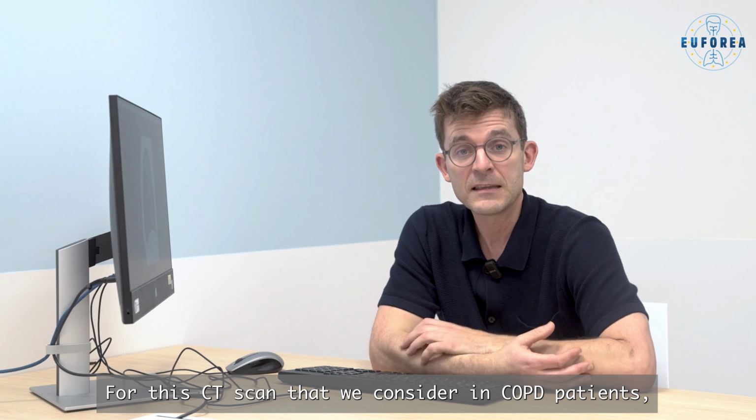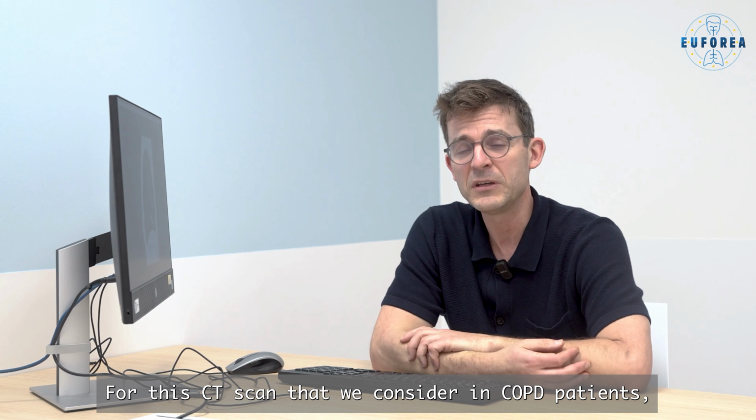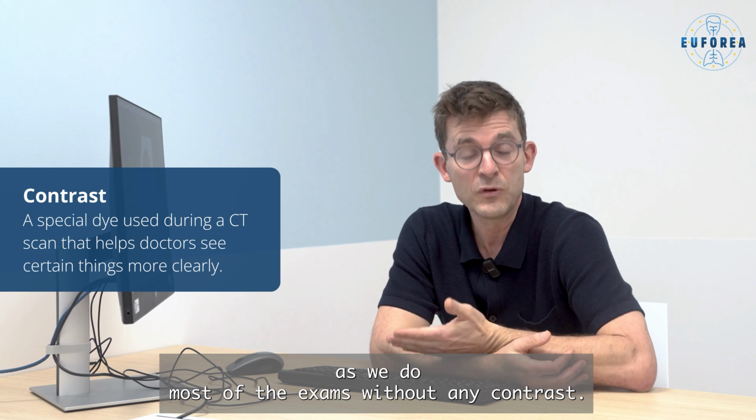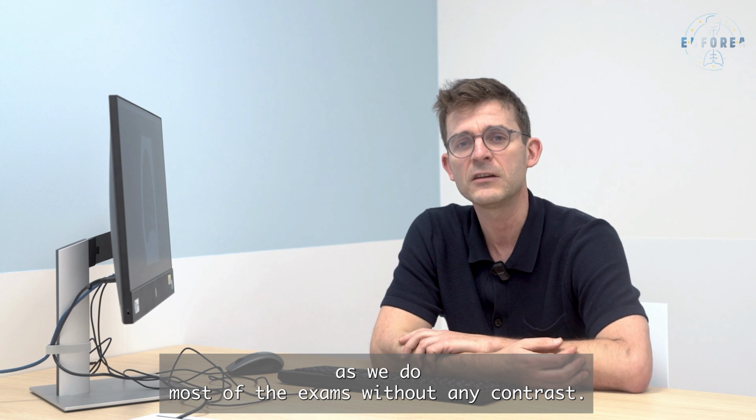For this CT scan that we consider in COPD patients, there is no preparation needed, as we do most of the exams without any contrast.